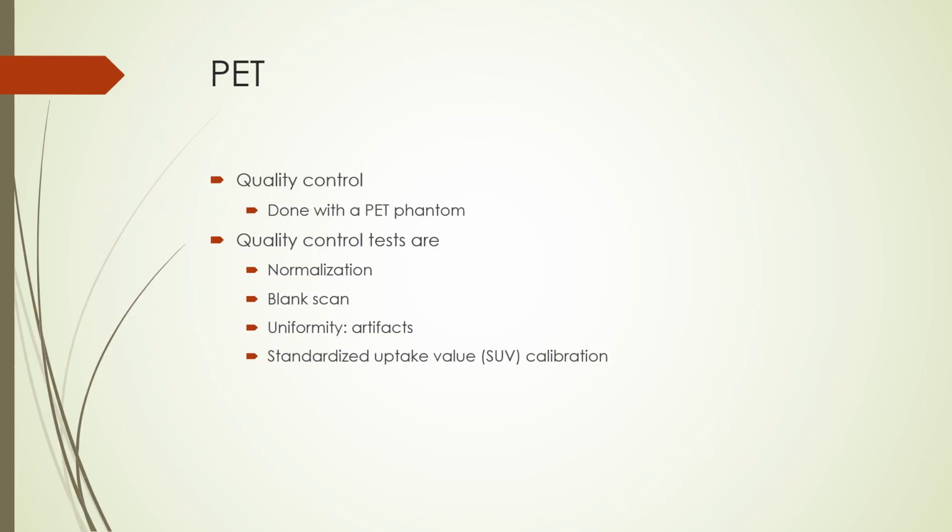To ensure a PET system is performing to specifications, quality control is important. A few quality control procedures are listed here. Quality control tests are done with a specialized PET phantom. We shall start with normalization and blank scans on the next slide.